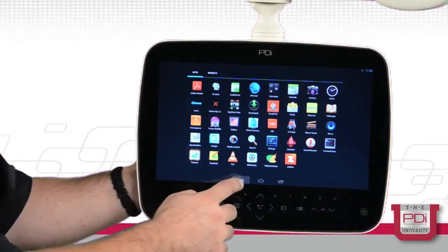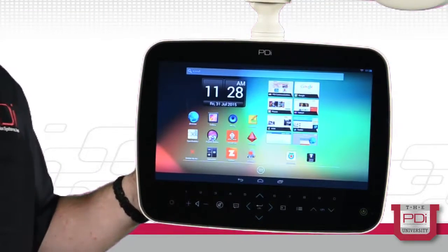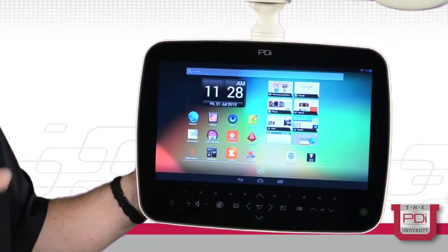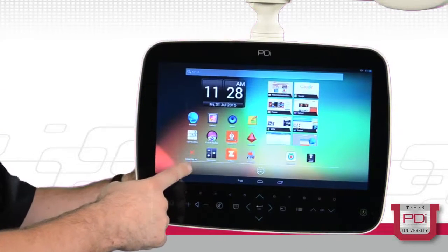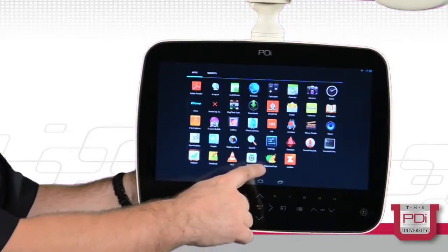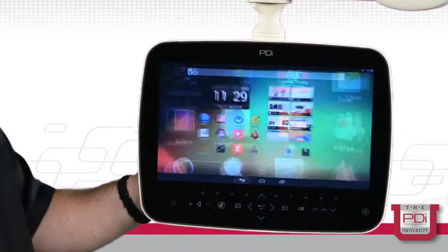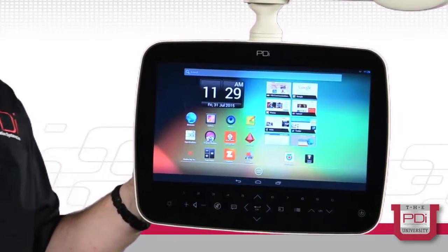With the patient, they can also decide they don't want to leave their profile, and they can delete it themselves. They have 2 ways to do this. You can select delete my account, which is the red X, and they also have wipe user data. They both will delete your account. If the patient wants to save their profile, they simply just need to log out.